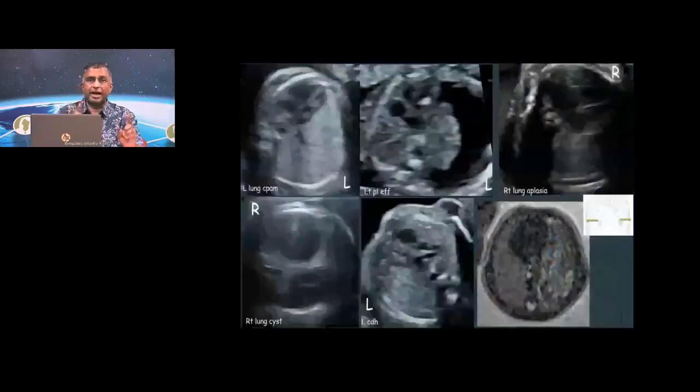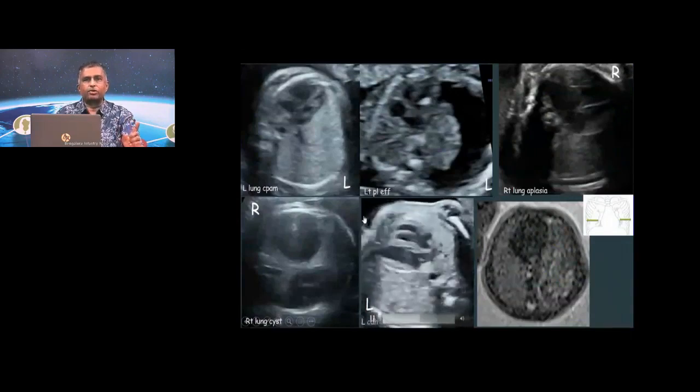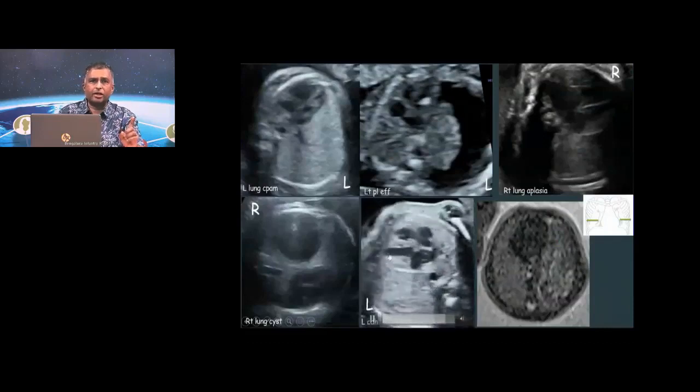Now, if you have that concept and if you have that in your checklist, when you do your heart as a whole, in that light, I want you to see this. Now, imagine a straight line here. This is left. This is right. You should see only 1/3 of the heart to the right of the line. And what's happening here?